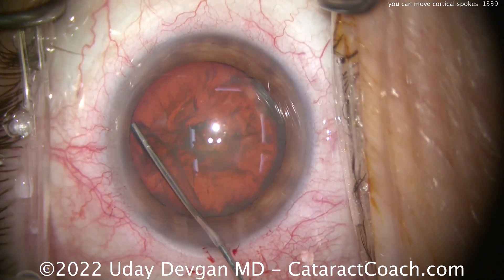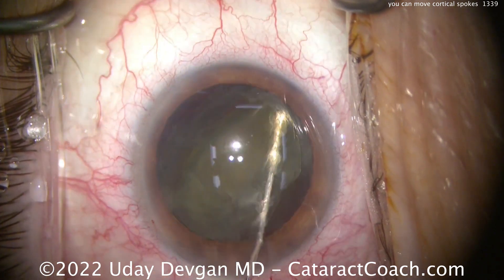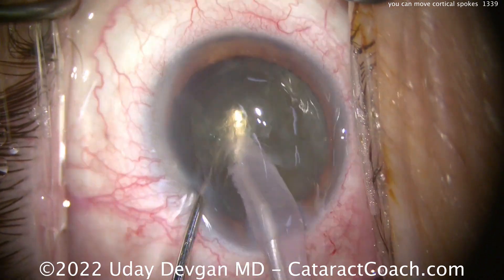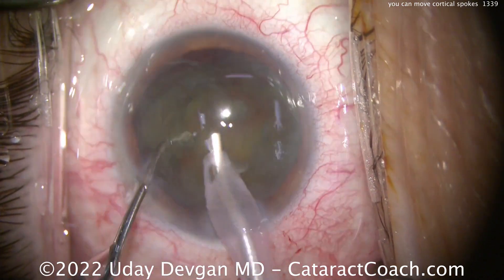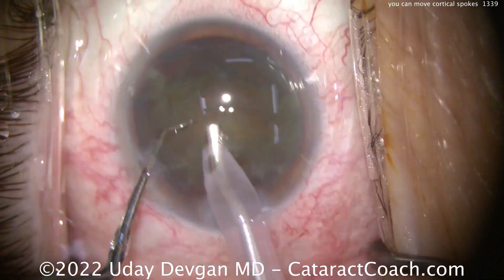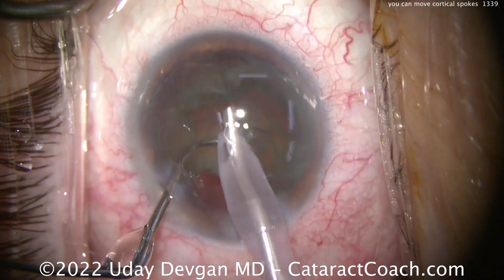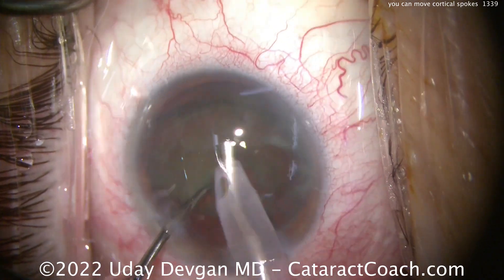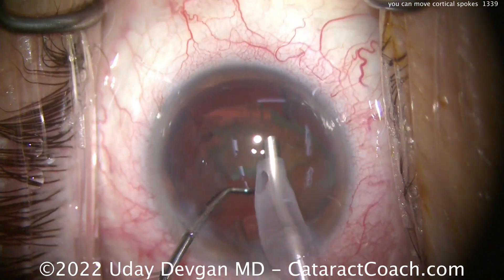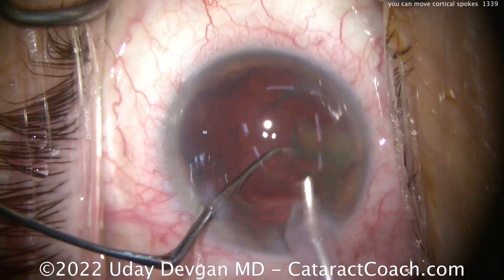Let's speed up the phaco part of the case. Not a very dense cataract — moderate nuclear density — but certainly the patient had visually significant complaints based on this lens opacity. Prolapse the lens partly out of the capsular bag, just a quick chop at the beginning to give two halves. Each sub-piece can then just be aspirated, really not much more chopping needed — more of a tilt and tumble. That nucleus comes out pretty easily. Chopper in that safe position just to make sure that posterior capsule doesn't come up. And the lens is removed just like that.